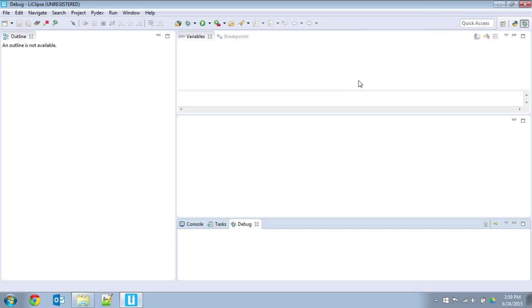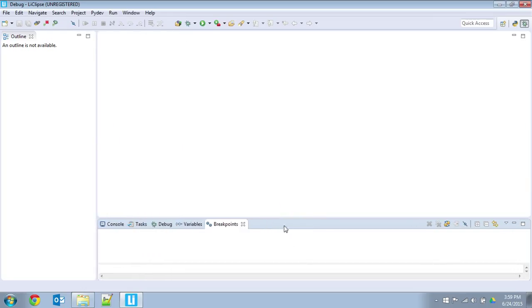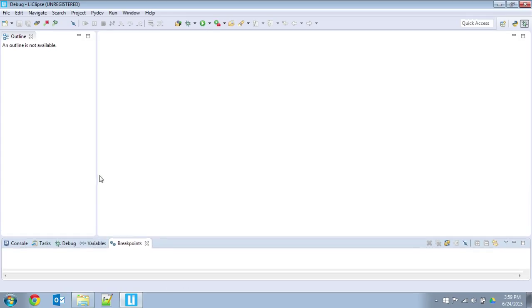I'm going to reorganize things as to how I like to work. You'll find your own setup, no doubt. But this is not bad for a single monitor setup. Typically, I have dual monitors. Okay, that's good enough for now. And I'm actually going to leave this because we're going to move over to Slicer now.